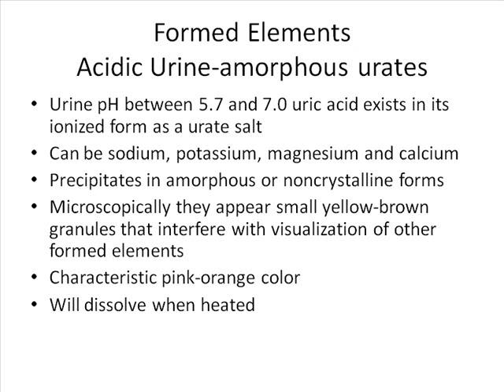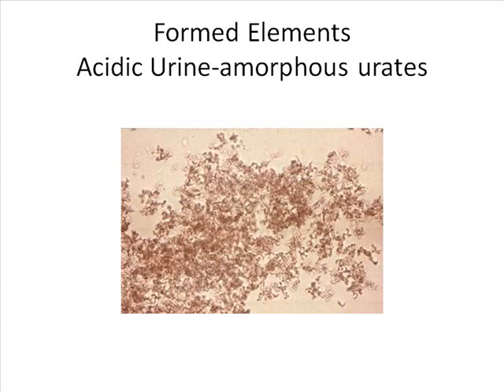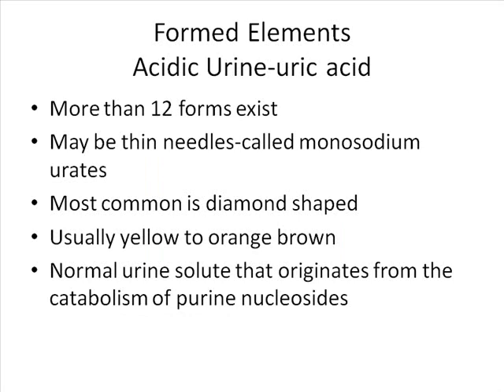When you centrifuge that urine, it almost looks like a pink sediment on the bottom of the tube. All right, that is totally normal. It's from urine that's been refrigerated. And it causes a lot of problems because if you try to look at it microscopically, it just fills your field with junk. Okay, this is what it looks like. Remember, don't confuse this with bacteria.